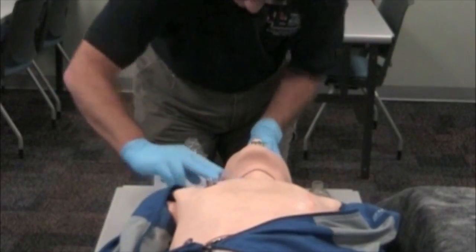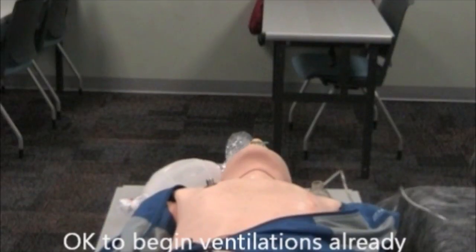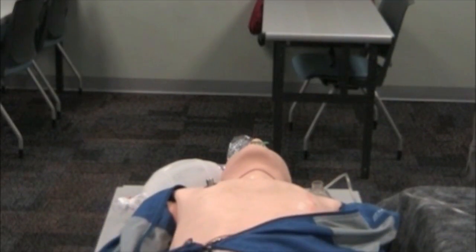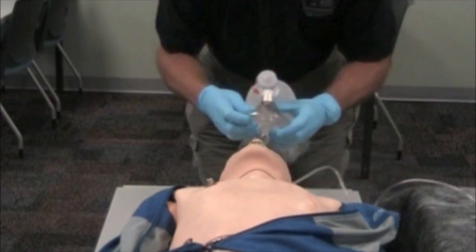At this point, I will hook my oxygen tubing up to my oxygen cylinder and turn the oxygen on to 15 liters per minute.